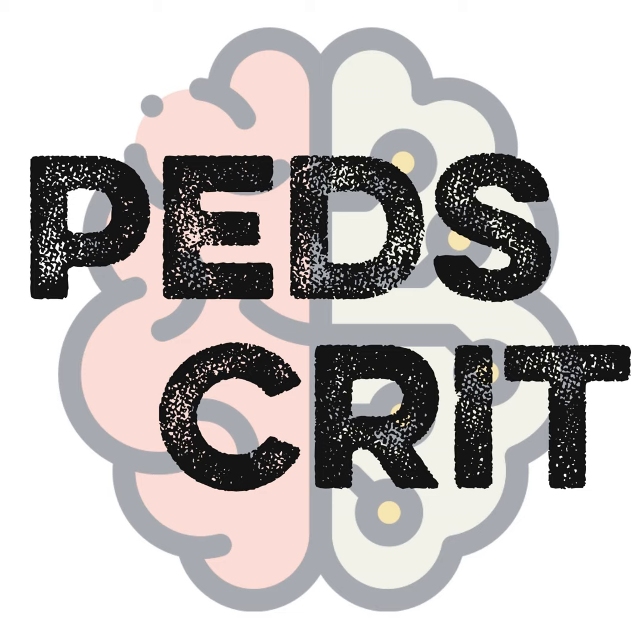All right. So we've got a 15-year-old boy with suspected myocarditis admitted to the CICU in cardiogenic shock. He's been refractory to an ongoing resuscitation. He remains hypotensive despite maximal medical therapy with a rising lactate and worsening clinical status. The ICU team is preparing to cannulate him to VA-ECMO.